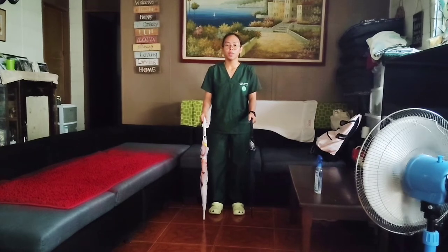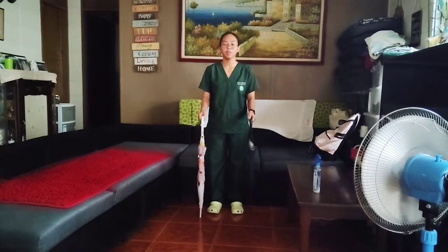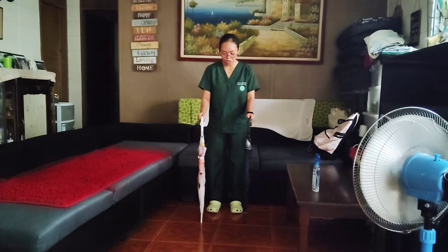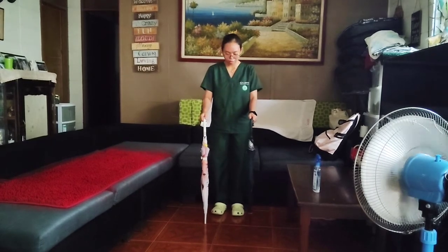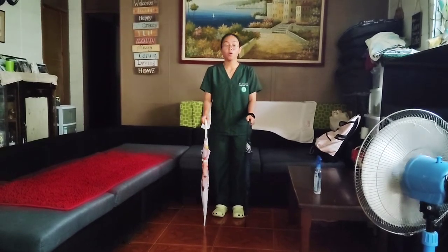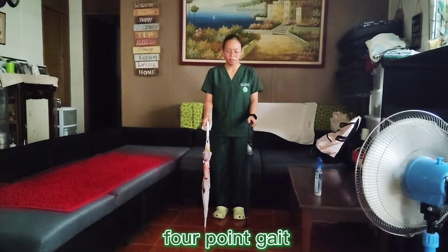Using these crutches, begin with the tripod position. Position the crutches in front of your feet, then walk using the 4-point gait.